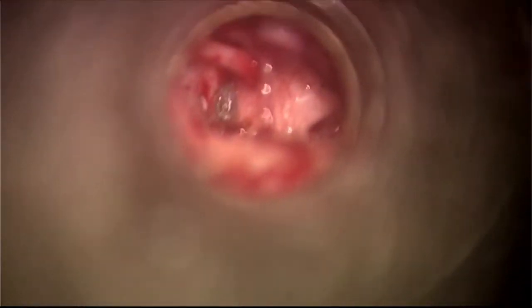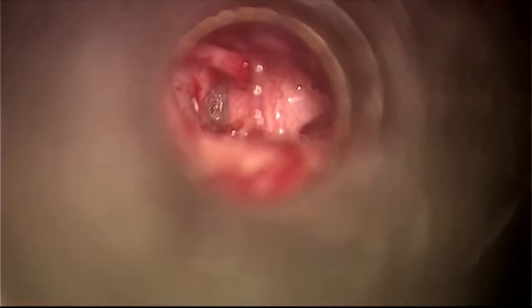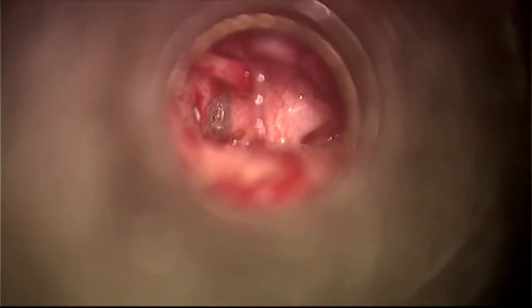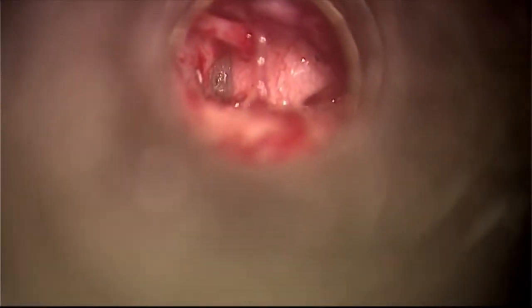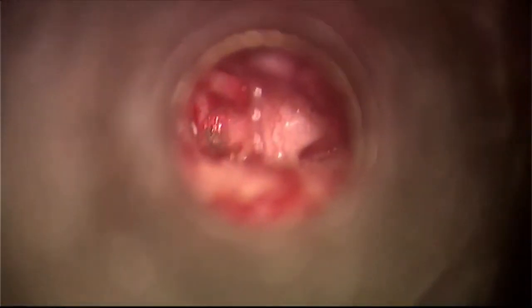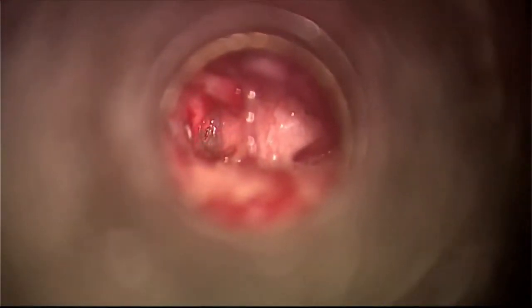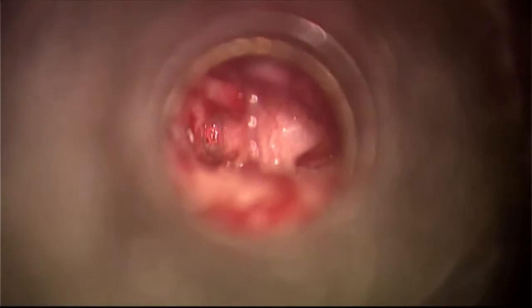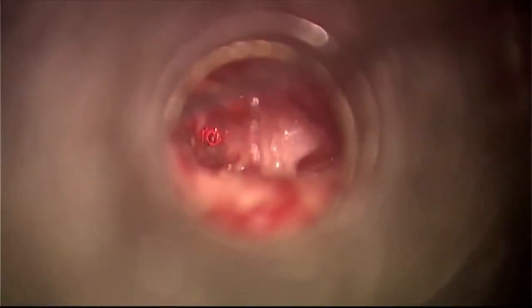Next, can I induce? Boss, you are doing so much wiggle of stapes with this piston. What's the difference? How much difference have you noticed in your cases from the Teflon? Night and day. Night and day, oh, perfect. And in terms of hearing, in terms of everything, sense of security, in terms of need of revision. See, you can say it is a sort of luxury. Okay.